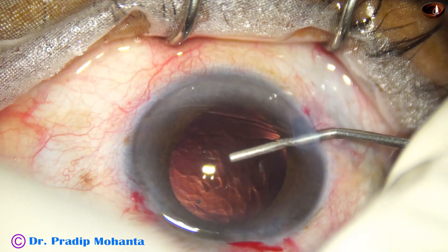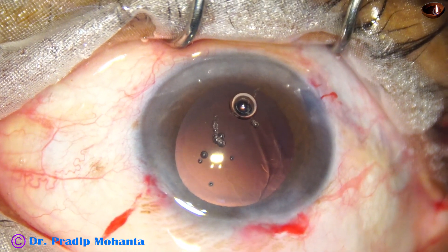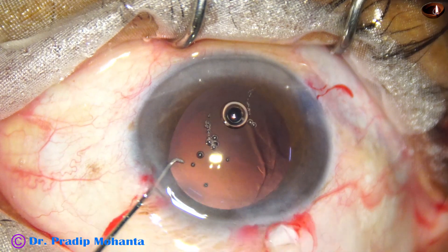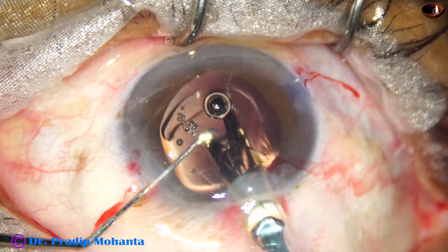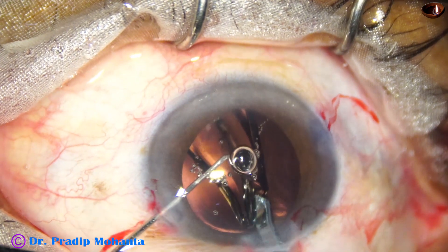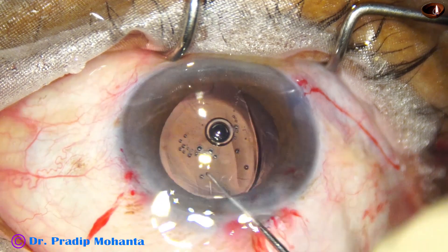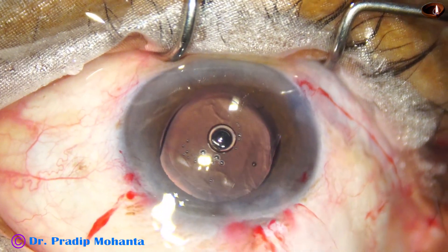Now the anterior chamber is filled up with two percent HPMC and the capsular bag is also filled up. A hydrophobic acrylic single-piece monofocal intraocular lens is implanted in the capsular bag. This is a small-bore cartridge and I have to go very slow while injecting through this kind of cartridge because the lens is compressed, and if we inject with high force it can go like a bullet.